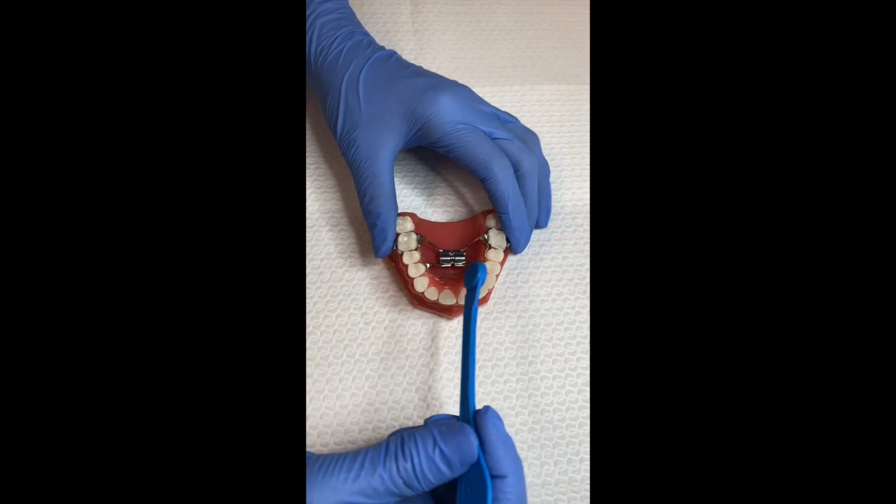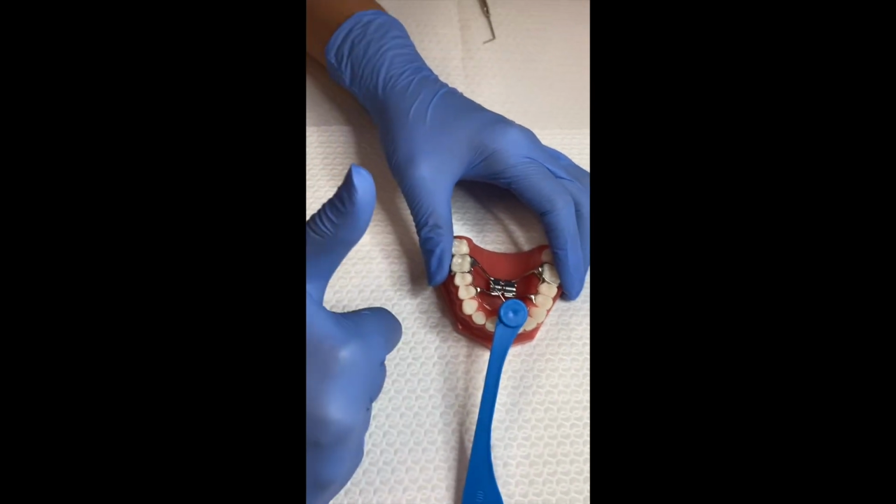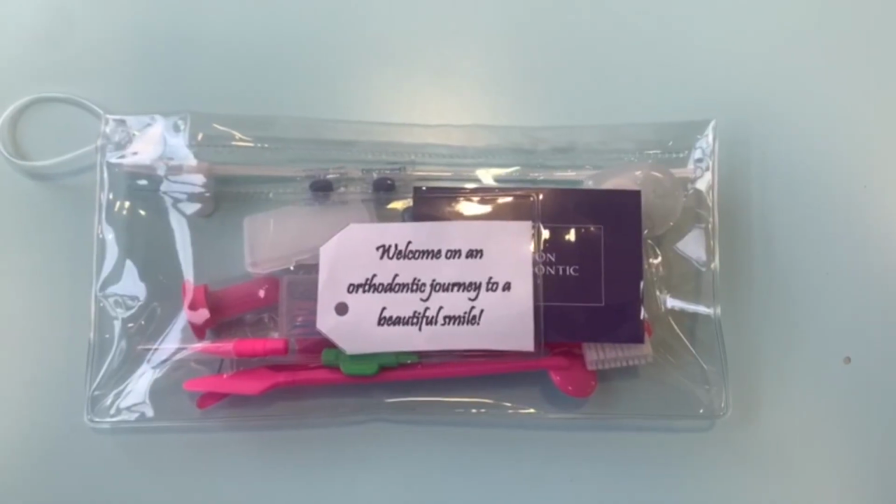To make sure, if you want to double check, place the key in the hole again. If the key goes in, okay, you are all done.